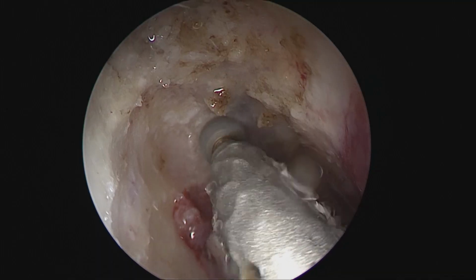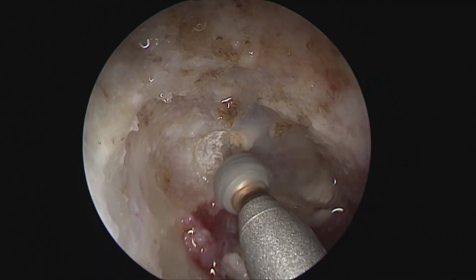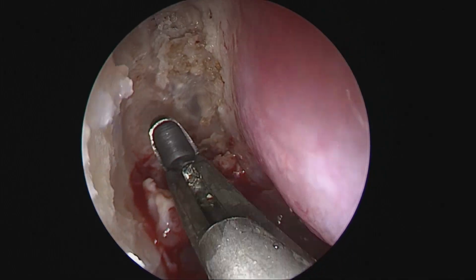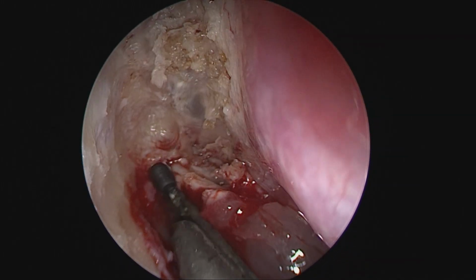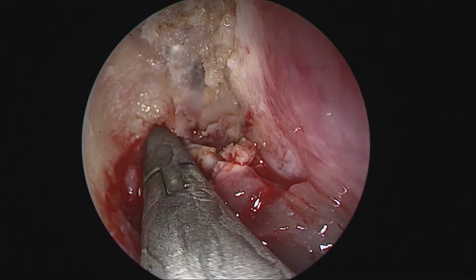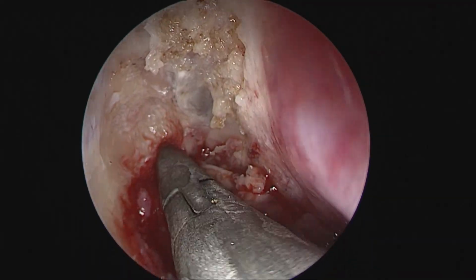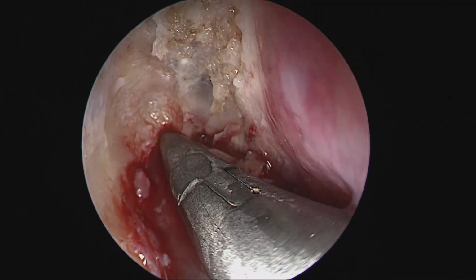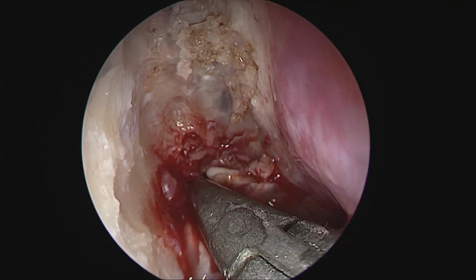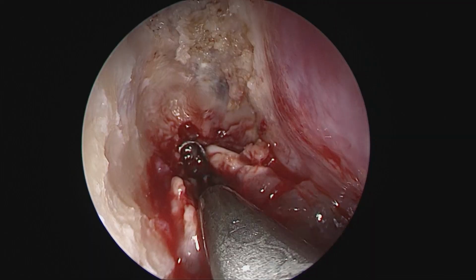As of now, we are still drilling and taking our time to drill around the lesion. We have still not violated the actual papillomatous pathology. And now you see, once we have located the beak here, we are using a curved articulated punch to get us access inside the frontal sinus proper, which would then become our anterior boundary of excising this lesion.